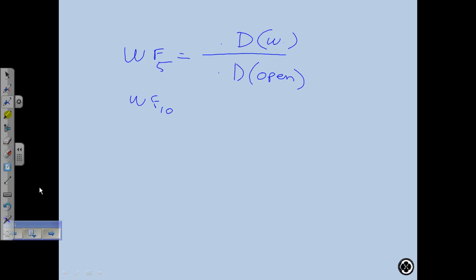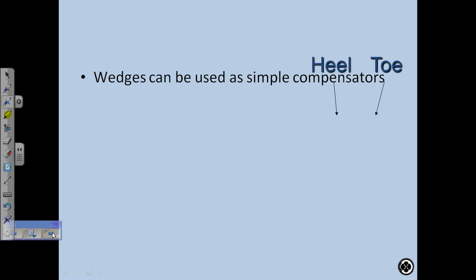The beam is slightly harder at 10 than it is at 5, just by a little bit, because it's got more attenuation. The beam's been attenuating through water more, so it's a harder beam at 10 than at 5. Again, small difference here. It's about 2% difference between 10 and 5, and 2% for the different field sizes. So there are small differences, but they're there.